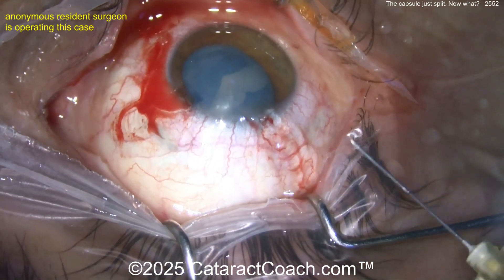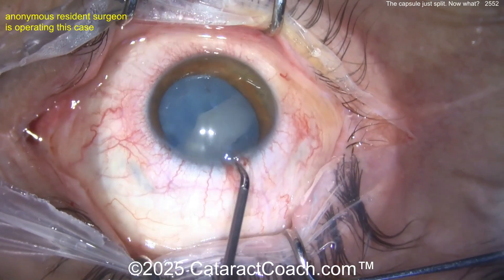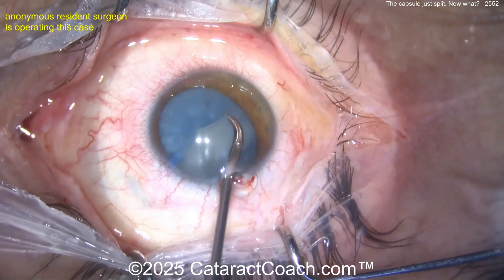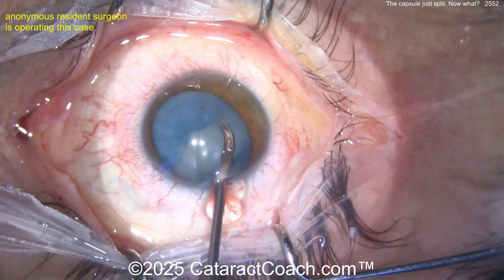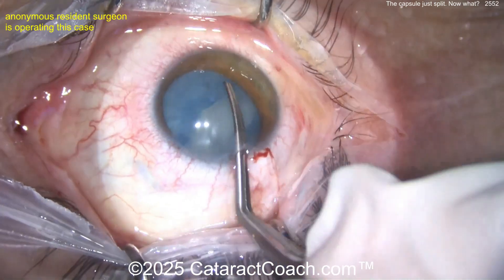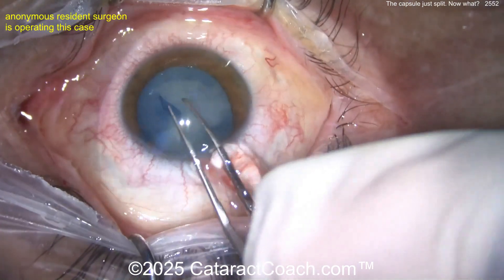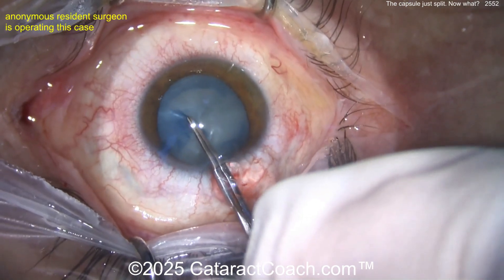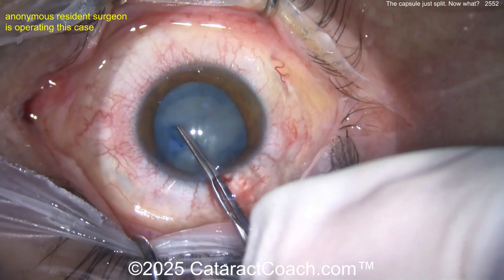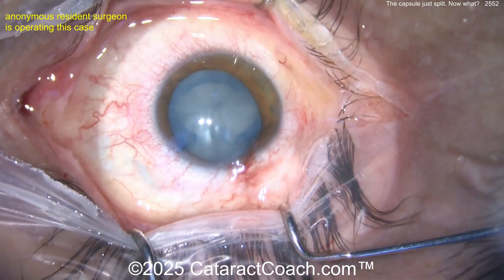Pow — there it is! Wow, wow, wow — now it's already split wide open. What are you going to do here? Surgeon is coming in with some micro scissors to cut this, going to continue to tear a rhexis or at least make a larger capsule opening. I'd want to get this thing decompressed already. You've got it split — that's okay, it's already done. What's done is done. See how this wants to run out because there's still some pressure there, with this big swollen lens nucleus.